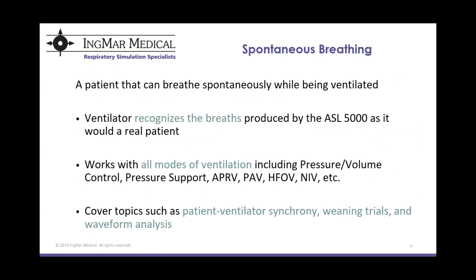Using the movement of the piston inside of the ASL 5000, you can produce real negative pressures sensed by the ventilator as a patient effort. This means you can provide training on any mode of ventilation, and you can craft real-life scenarios on advanced ventilator management topics, such as patient ventilator synchrony, weaning trials, and waveform analysis.